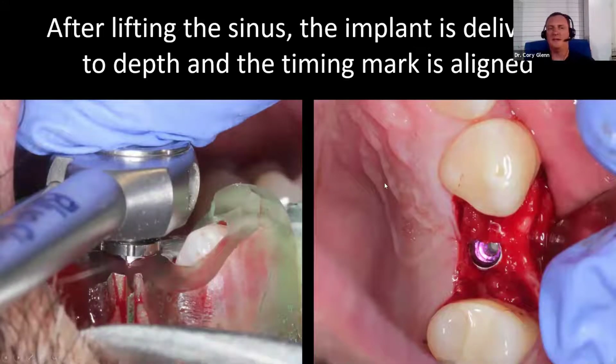And then once he placed a little bit of bone graft in there and lifted the sinus, now he places the implant. And you can see the picture on the left has the mark on the driver. There's 6 of these. They all correspond to the flats of the implants. So here's my timing mark, and I've got to make sure that that driver mark lines up exactly to the timing mark. So we did that. Our stopper is bottomed out, so we know it's at the right depth. And when we remove the guide, this is our implant.